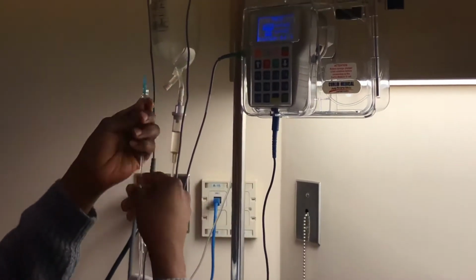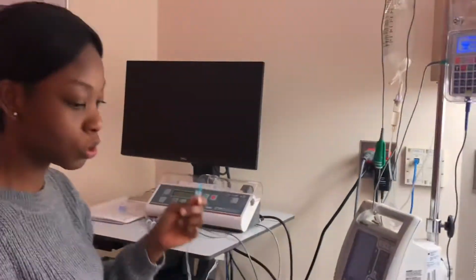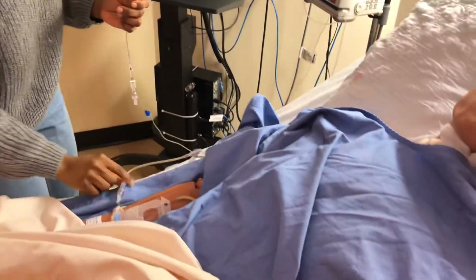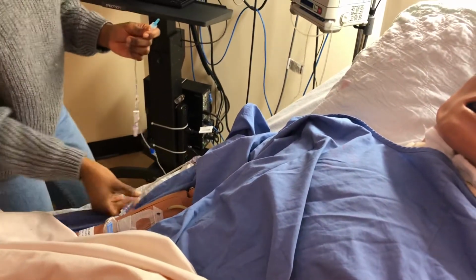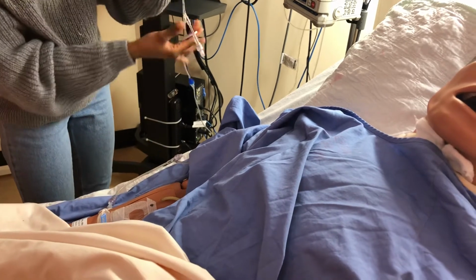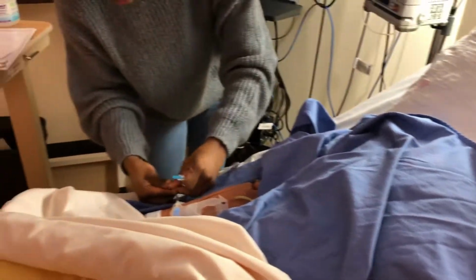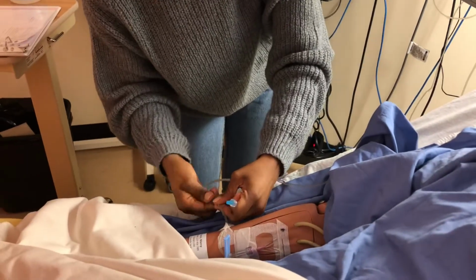So next, now I have primed, so I will go ahead and attach to the patient. So I already clamped this. So I'm going to take this out.